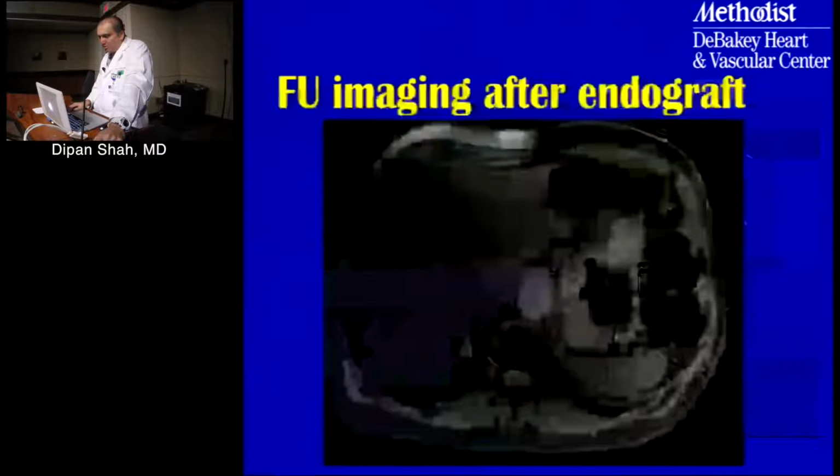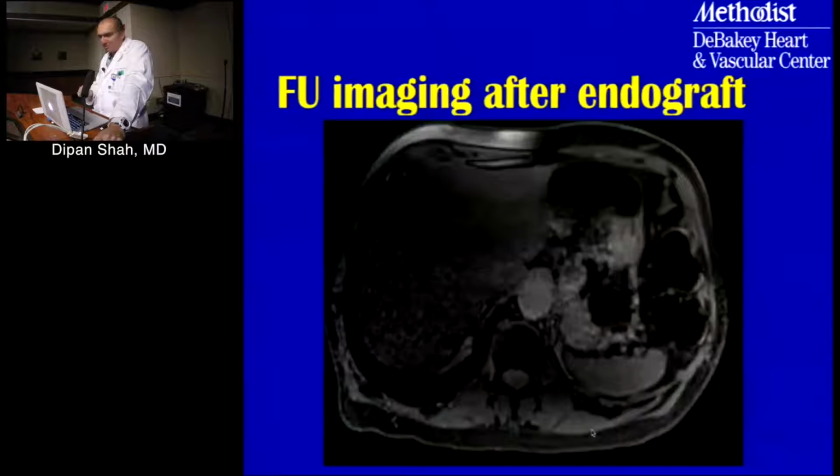Okay. So, the last thing I want to touch on is another potentially common indication for imaging, and these are patients that get endografts put in.